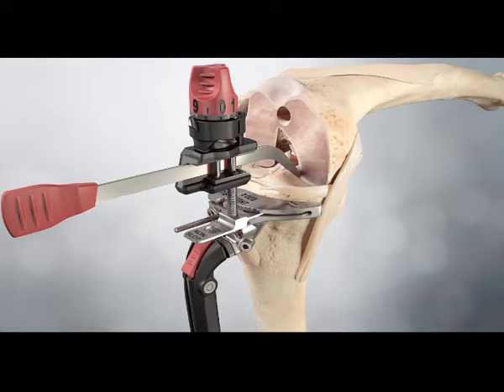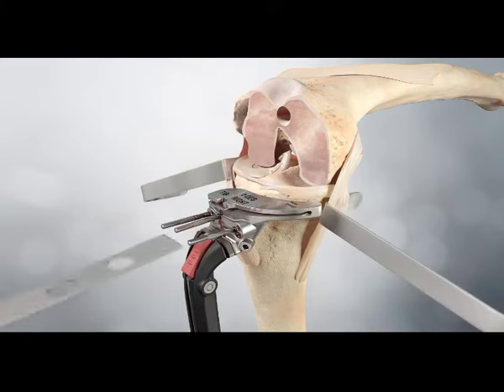Once the position of the tibial cutting block has been selected, the block is pinned through the centreline holes and the tibia is resected.